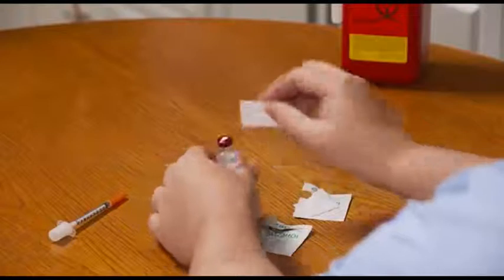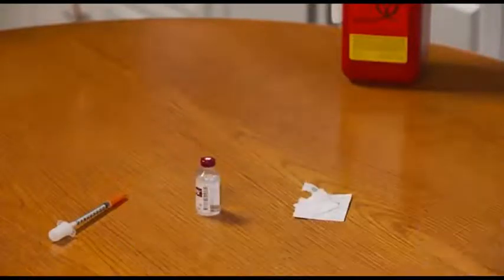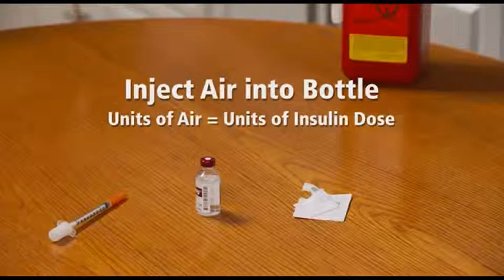Next, use one of the alcohol swabs to wipe the top of the insulin bottle. Then let the alcohol air dry. Now, when you draw insulin, the first step is to inject air into the bottle equal to the amount of insulin that you intend to take from the bottle. This makes it easier to get insulin into the syringe.